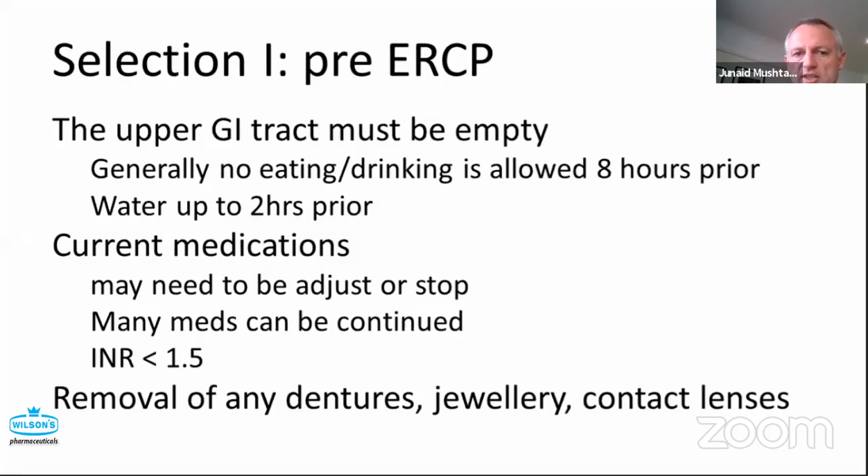So let's talk about patient selection. Before we even talk about the ERCP, what do we need? The upper GI tract must be empty. Generally, we say no eating or drinking. Often our ERCP lists are morning lists, so we say nil by mouth from midnight. In truth, our anaesthetists are happy if patients are allowed to drink water, only water, up to 2 hours prior.